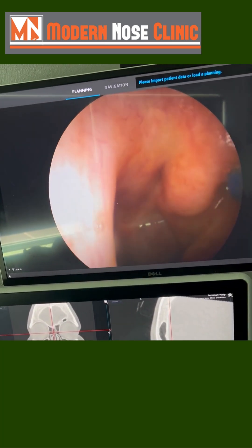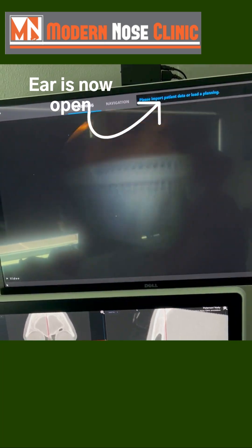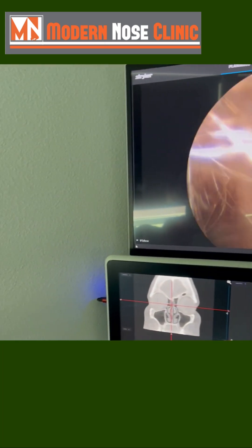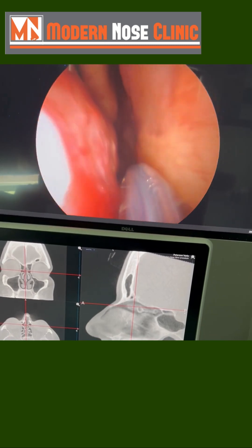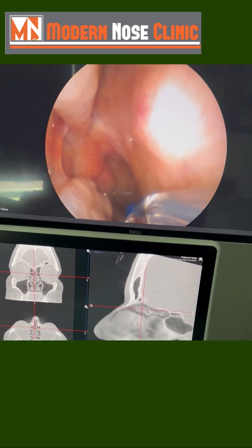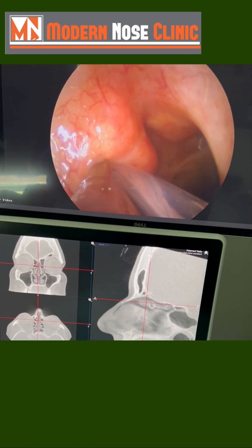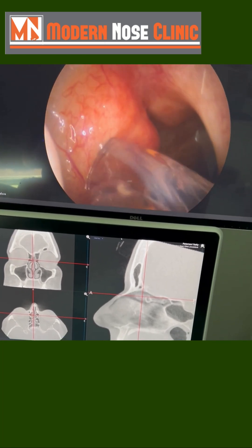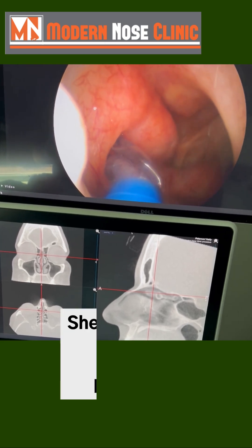Take it on out — obviously you want to get it completely in. Now demonstrating the other side: easy breezy lemon squeezy. Come in here, and there's the opening of the Eustachian tube right there. It's a complete landing — inflate.